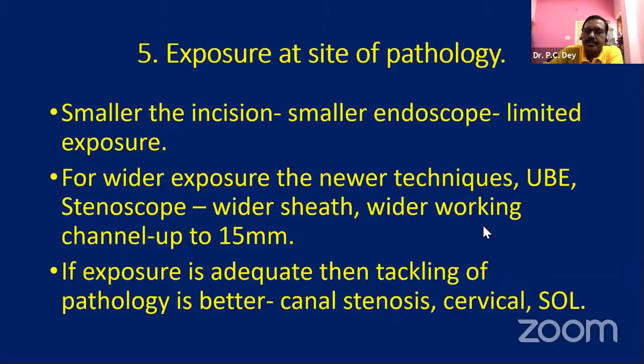Monu, please go ahead. What I feel, as a person who is the latest entrant into this technique, is that Dr. Srinivasan is spot on. First of all, what is important is visualization. You have to have a wide visualization and you need to see the boundaries correctly without distortion, and you should be able to observe them minutely, not just what is there in the center, but what is there in the periphery, in the nooks and the corners. So I feel with the mobility of the system that we are using, the Destandau, it scores a point over other systems on that aspect.